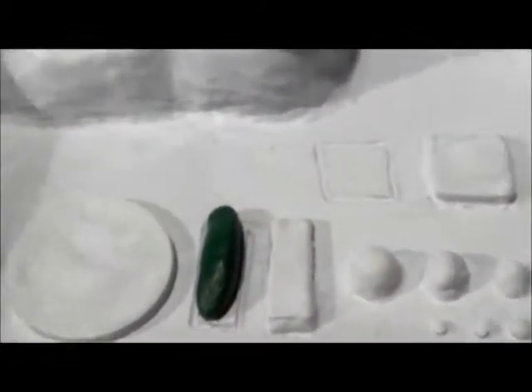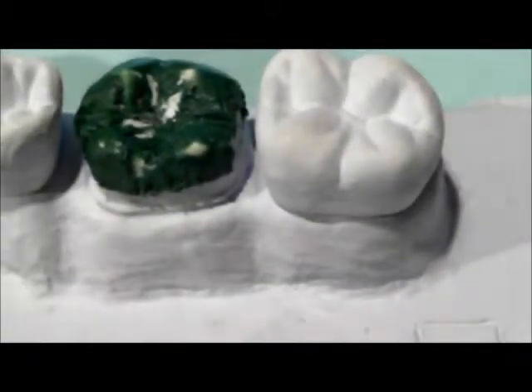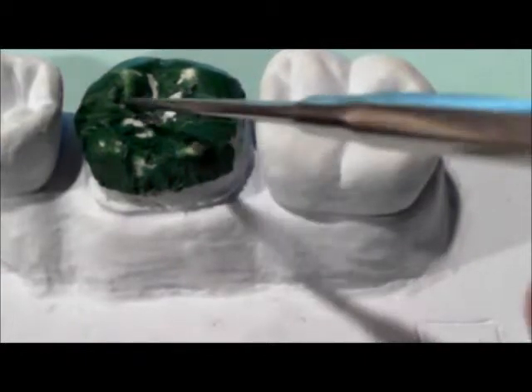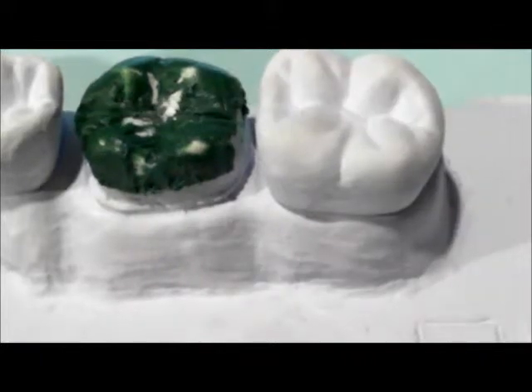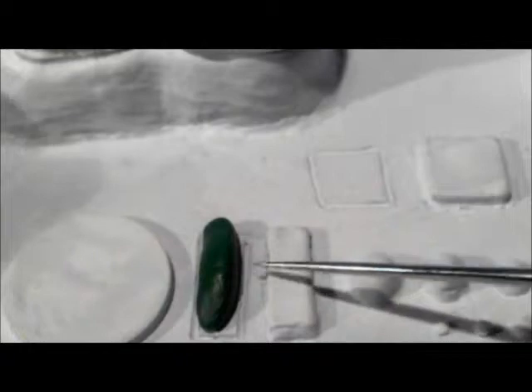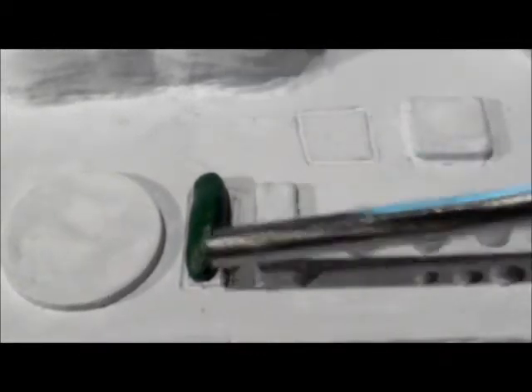Now the next step we're gonna do, we're gonna go ahead and make the contact areas. Okay, in the proximal spaces here, I'm gonna make another little flat disc. I already kind of formed it just a little. We just put it right in there and take a little piece of wax and just form it like this. And I'll just take my instrument and just go back and forth just to flatten it. And you've got to keep it to this shape here. Okay, just roll it out.